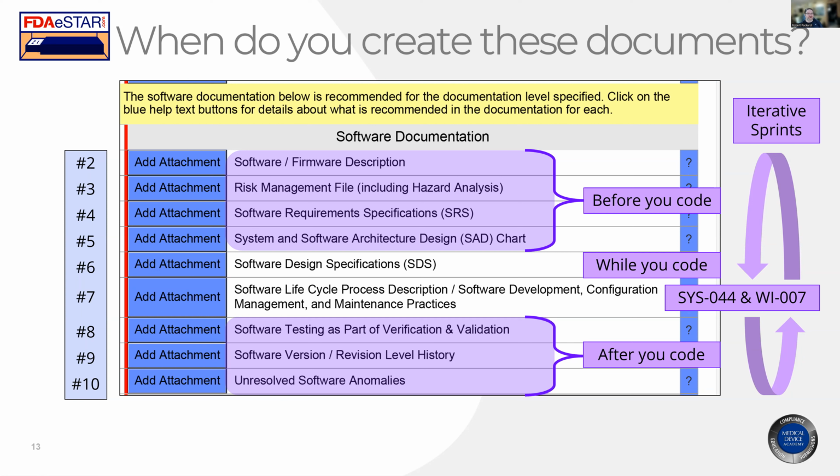Now, while you're coding, you're going to be working on your design specification. You might write the design specification and then code. You might code and then write your design specification.